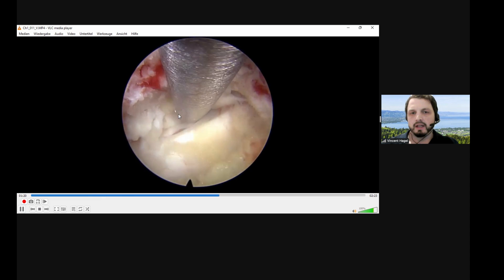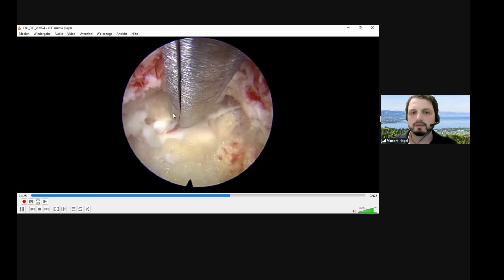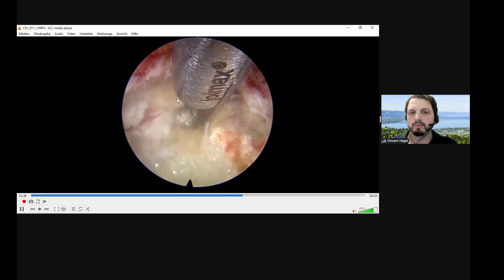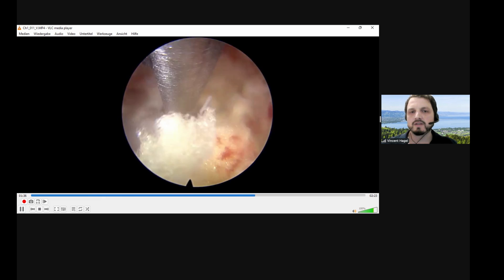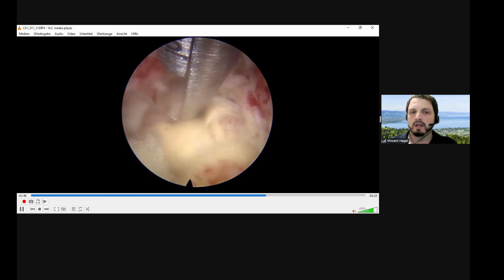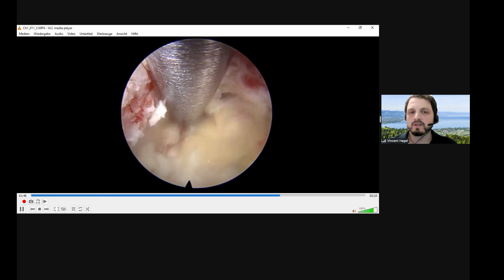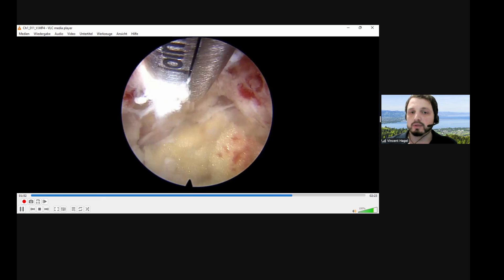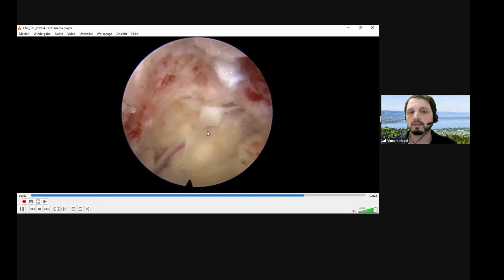It happened where I didn't notice it. But still, it is a fairly small dural tear where you can see the fascicle itself right there, but it's not really pushing far out of the defect. Therefore, in such cases, it's usually not necessary to do anything. The big benefit of performing a procedure endoscopically is that you have very minimal approach trauma, which means there's not really a big hole on the way down. And on the other hand, there is also very little space for CSF to find its way up to the skin.